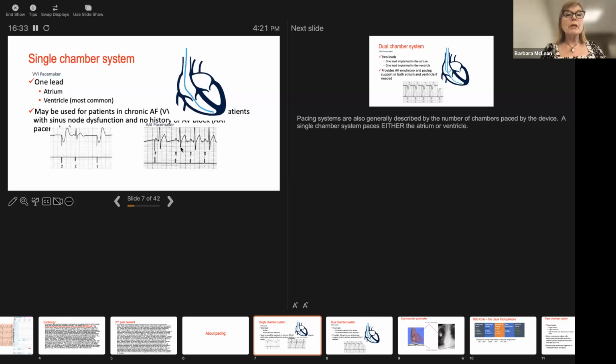And then we look over here, this is your atrial spike, but normally with atrial pacing you can't really see the P wave. That's a hardship for us, because we can always find a lead where we can see a ventricular spike and ventricular capture. We can't always find a lead where we're looking at atrial spike and atrial capture. We might see the spike, but we typically don't see the capture.